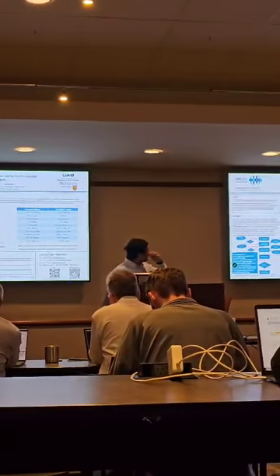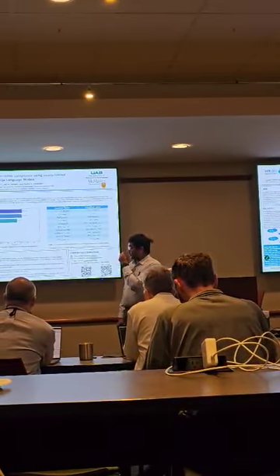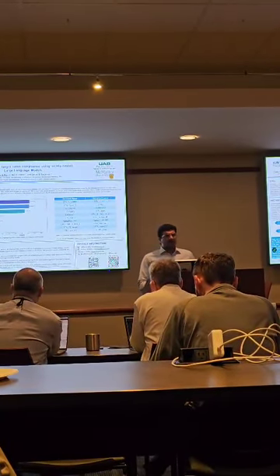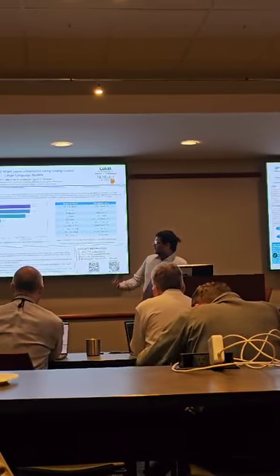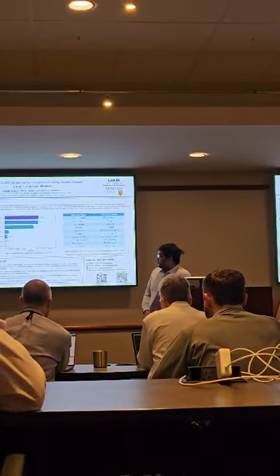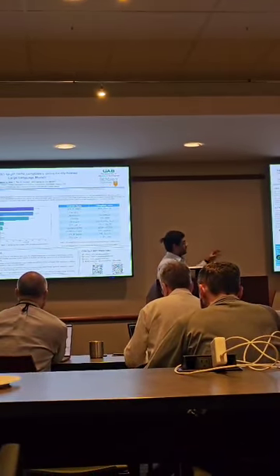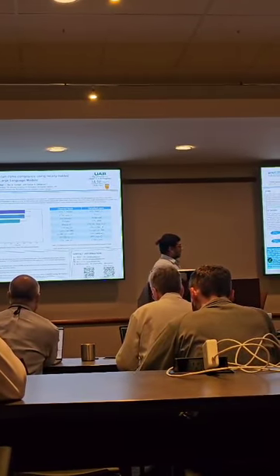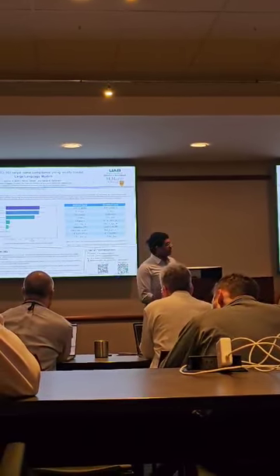Now the way we did it was we would have the initial so-called incorrect name. In this case, we're using the example GTV_6th_rib_R. We asked the LLM to make a description of what they think the radiation oncologist was meaning to say in this specific context. So in this context, it would say the gross tumor volume is located on the 6th rib and the laterality is the right side. And then from that description, we can extract certain metrics or qualities about that specific name. So we can say what the target type is, what the dose level is, what the fraction count is, what the crop away from the body is, all of these other things that TG263 very specifically prescribes.